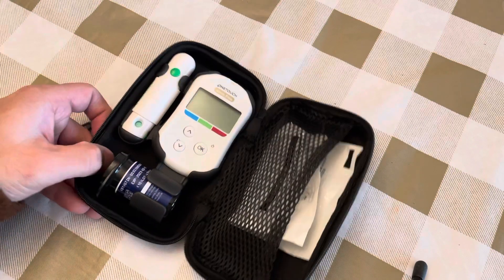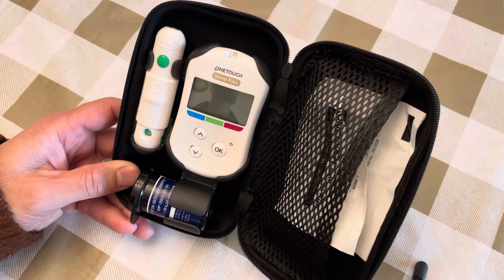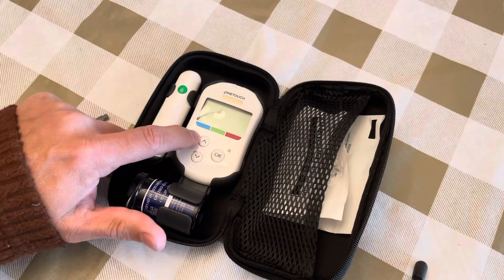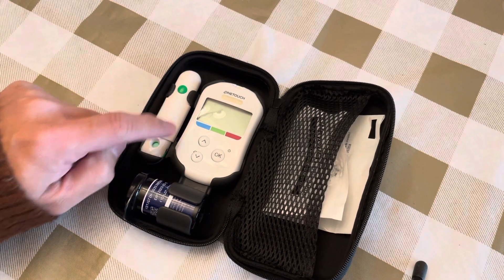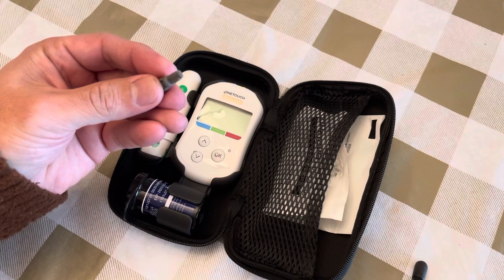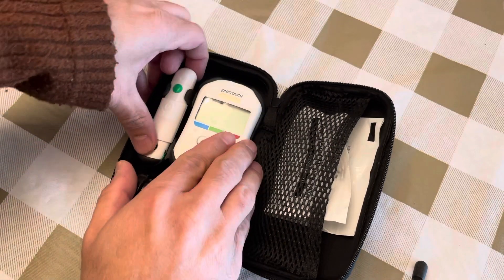This is the OneTouch Value Flex glucometer to check your blood sugar. It comes with the meter, the lancing device, the strips, and a pin — all in this pouch. Let's get started.